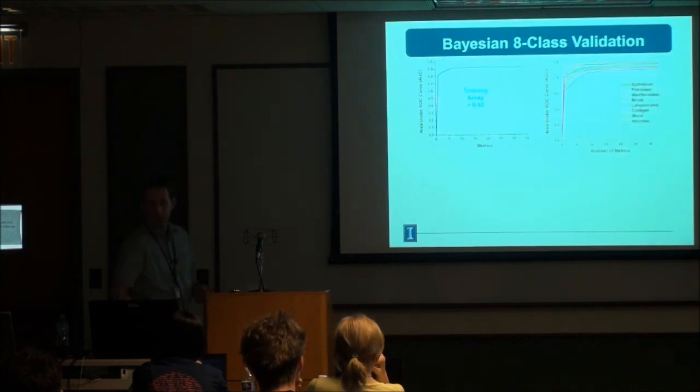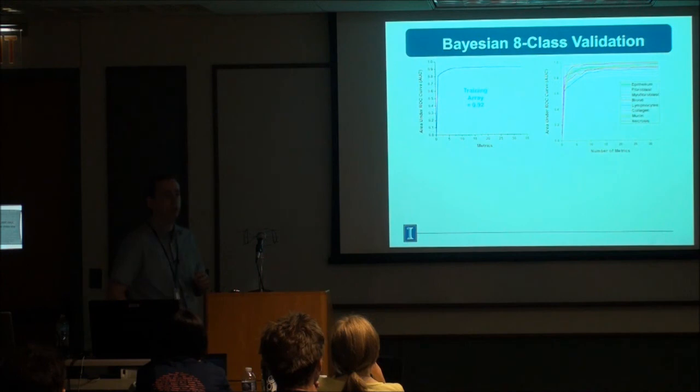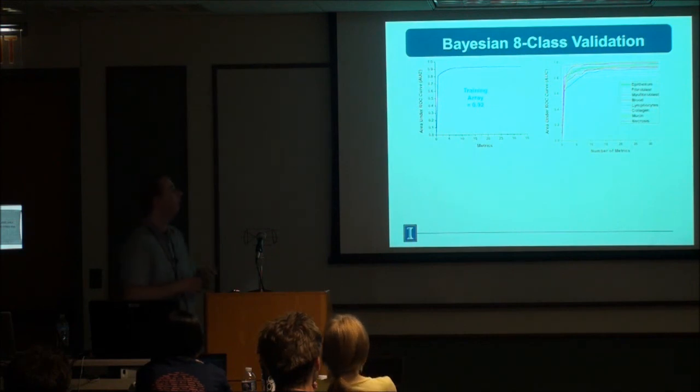Okay, so this works really well. When you rerun on the training set, you can see you get a very high accuracy of 0.92 area under the ROC curve. This is actually very high. If you look at things like just epithelial stromal segmentation in visible images, you're typically looking around this range. And we get slightly above this with many, many different cell types.